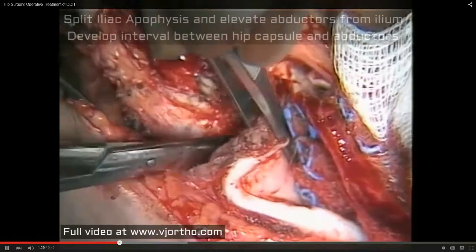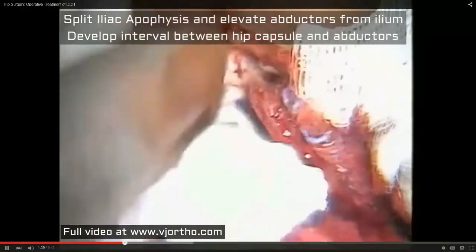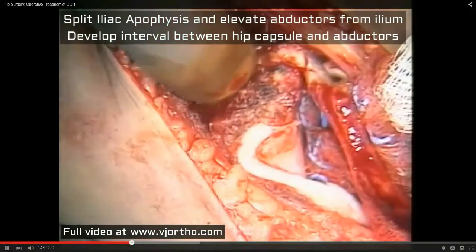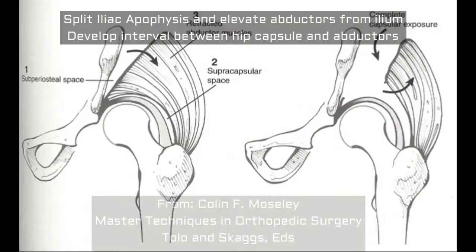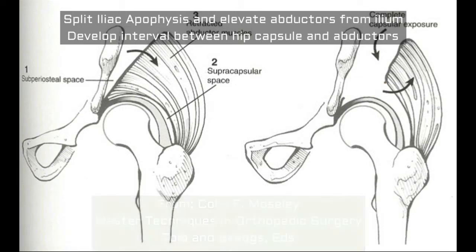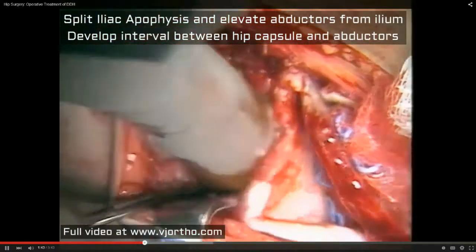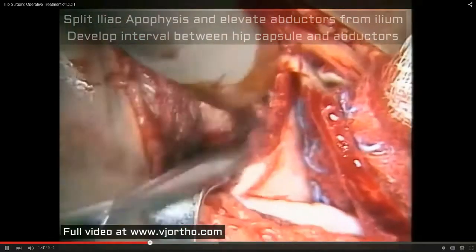These abductors are down and adherent to the hip capsule, and as you can see, we're beginning to expose the hip capsule. I'm taking scissors back superiorly and developing a pouch between the abductor muscle and femoral head. This potential space has to be cleared so that this capsule can be pulled distally, and the abductor muscles, which were scarred to it abnormally, can be separated.